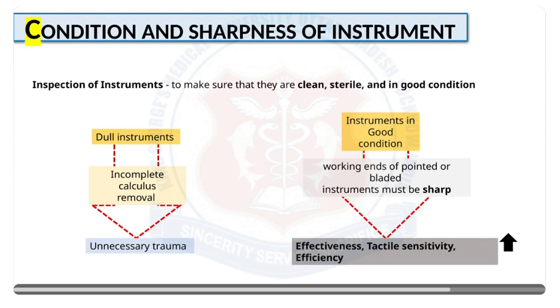Inspect instruments to ensure they are clean, sterile, and in good condition. Sharp working ends of pointed or bladed instruments enhance effectiveness, tactile sensitivity, and efficiency. Dull instruments lead to incomplete calculus removal and unnecessary trauma. Maintaining instruments in good condition is crucial for optimal performance.